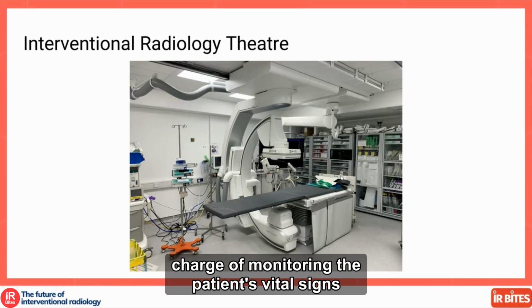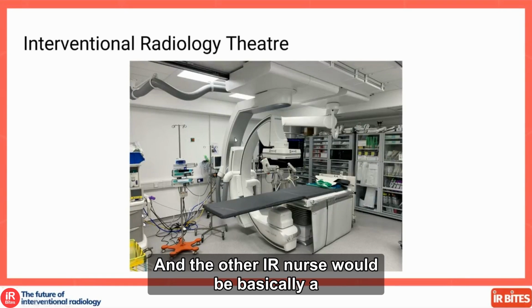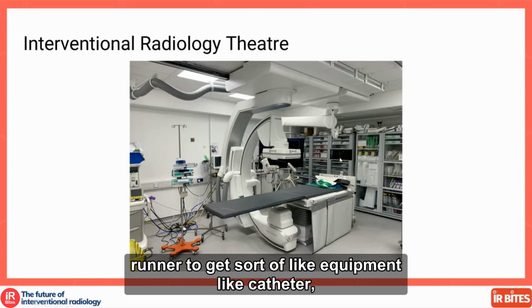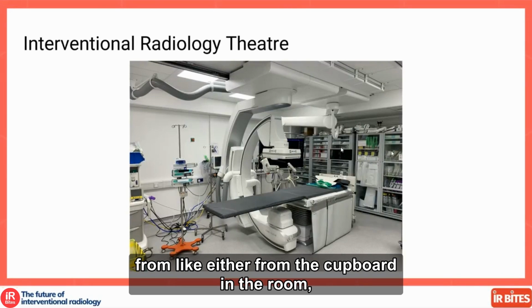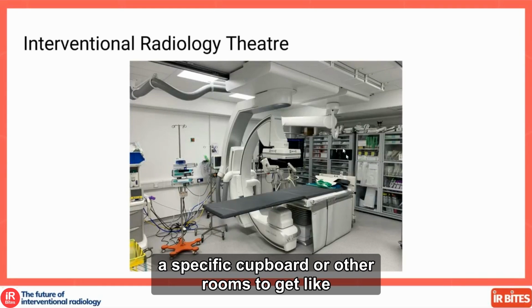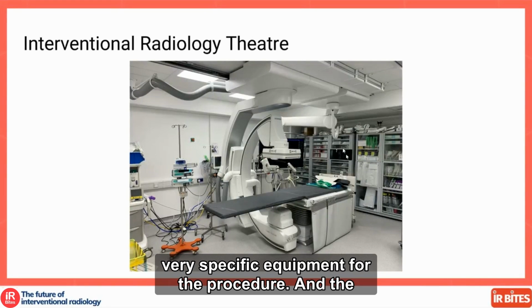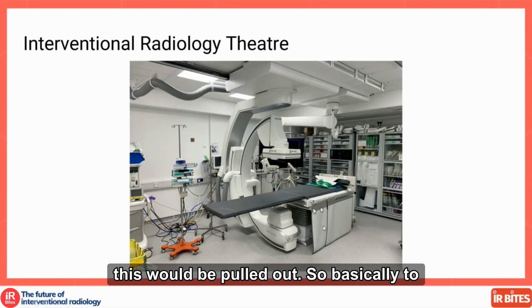One will be in charge of monitoring the patient's vital signs during the procedure, so that's the obs machine there. And the other IR nurse would basically be a runner to get equipment like catheters, different types of wire, sheaths, stents and balloons, either from the cupboard in the room, or sometimes they might even have to go to a specific cupboard or other rooms to get very specific equipment for the procedure. The lead shield, when they're actually doing the case, this would be pulled out.